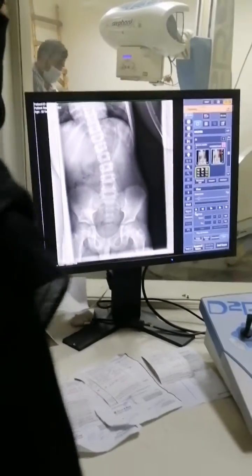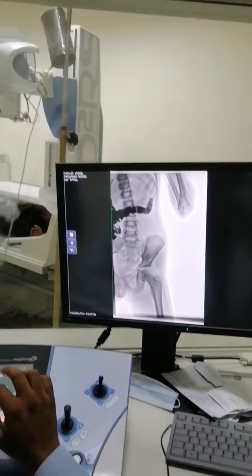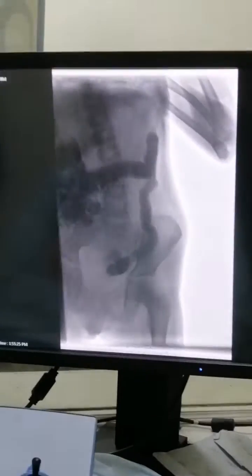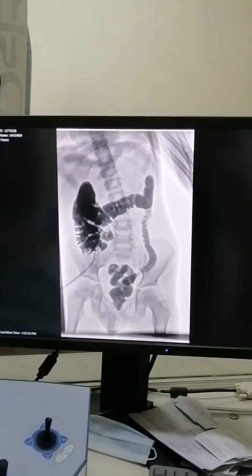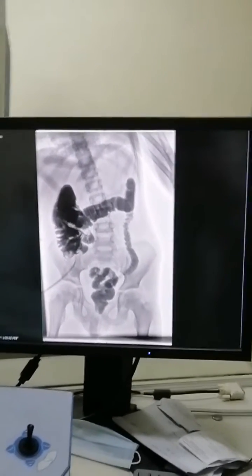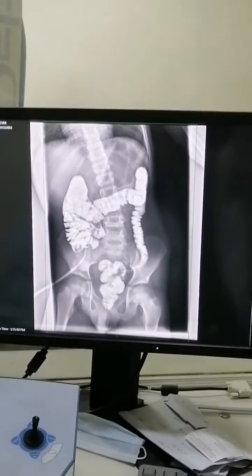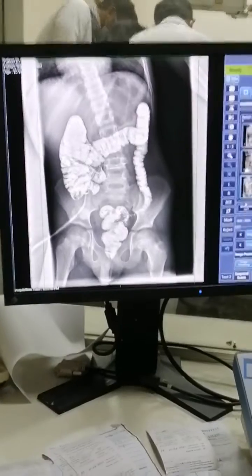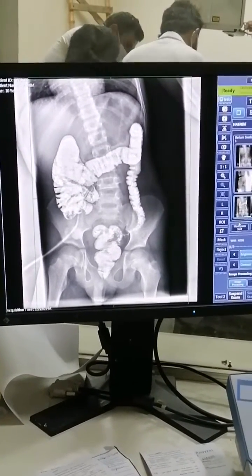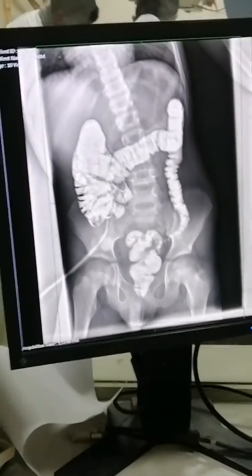The procedure being done here is called a distal loopogram. A distal loopogram is mainly an x-ray examination — a fluoroscopic study of the ileum — performed routinely for loop ileostomy. We use a water-soluble contrast in the distal segment to check the integrity of that segment. If it is intact, we proceed; but if it is not intact, the loopogram will show absent passage of contrast into the distal segment or into the rectum.